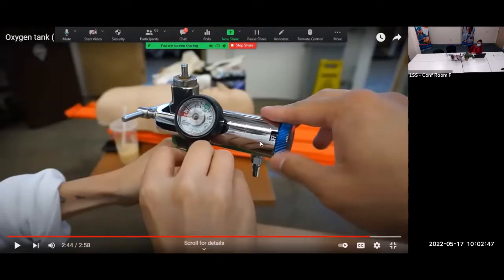So what you would do, after you close up the tank, is turn the dial to the oxygen back on. You'll hear a hissing noise of the oxygen escaping from the regulator, and that's fine. And once you don't hear any more oxygen coming out of the regulator, you turn it to 5 or full blast, and you'll hear a sound as the oxygen escapes. Once that sound finishes, you can turn it back off again, and you'll be sure there is no more oxygen in the regulator. The tank is closed. You can put the canister away for storage.